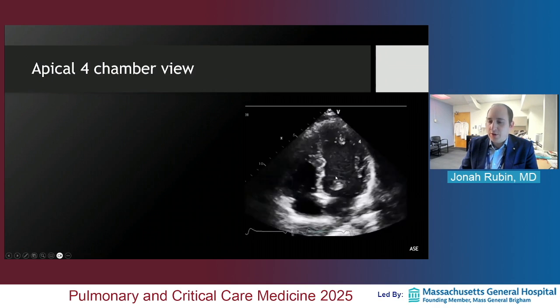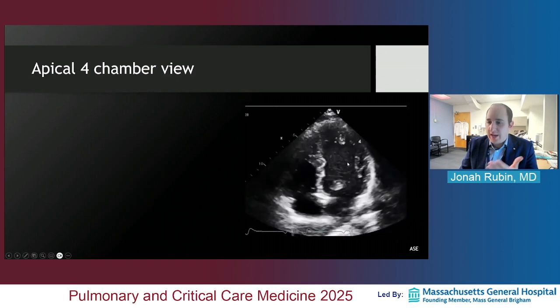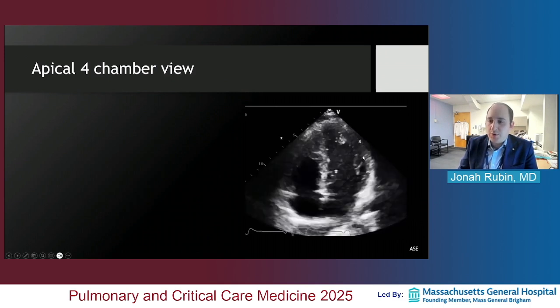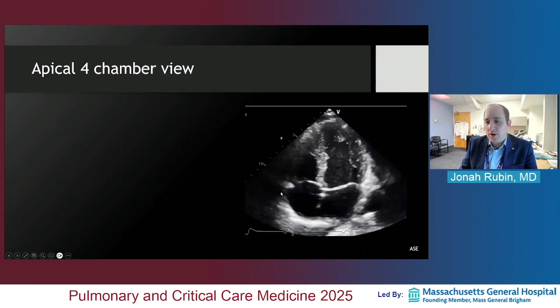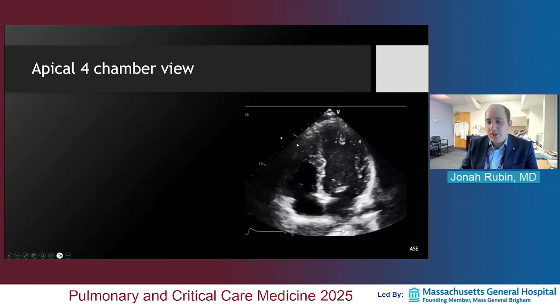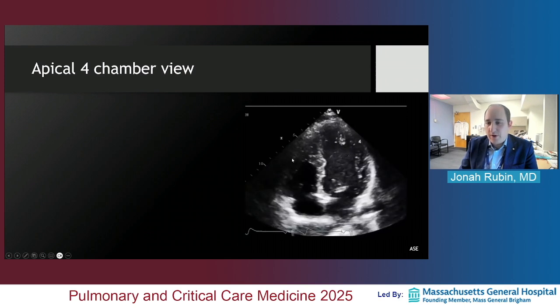You could do that on the parasternal long axis. On the parasternal short, you don't get excursion because you're looking at it in cross section. You are only able to see thickening and chamber contraction. And if you look at the RV on this view, on this particular clip, it's unfair. I'm not giving you a good view of the RV free wall.